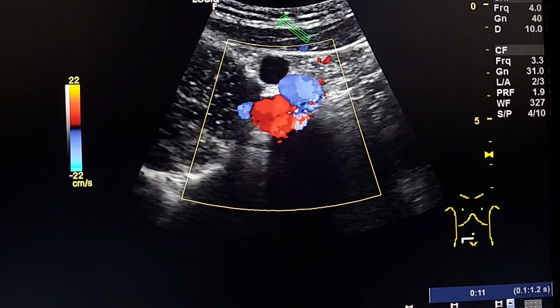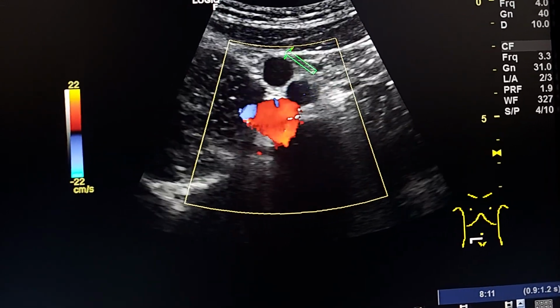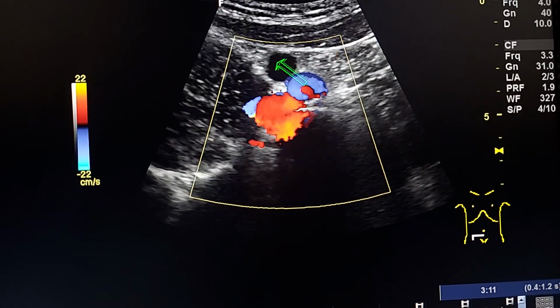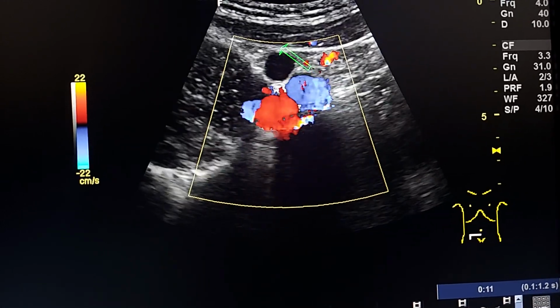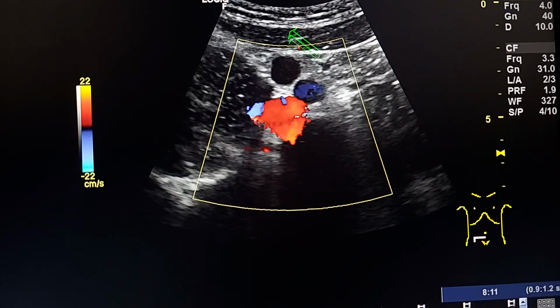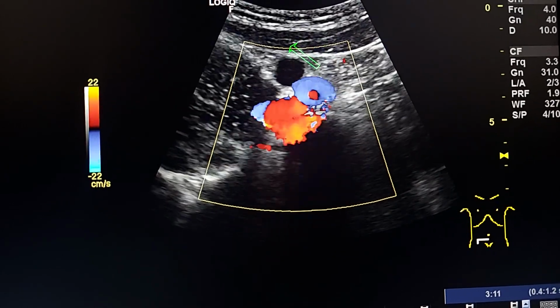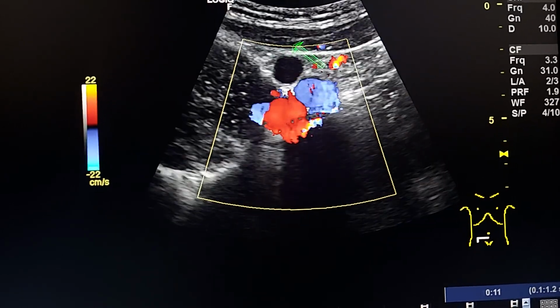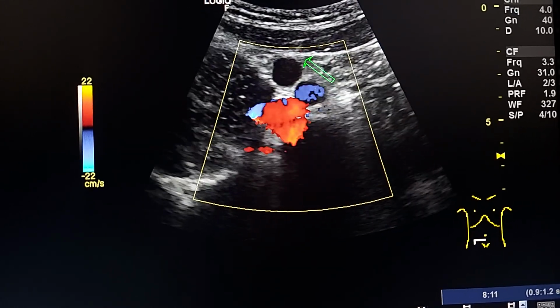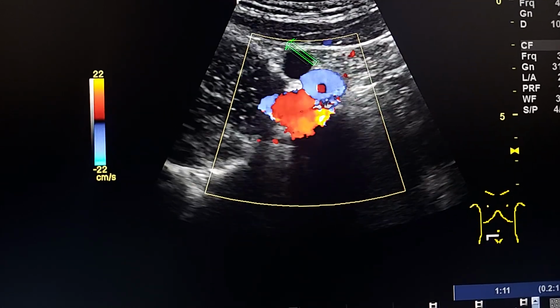Here we can see that the anterior abdominal wall is directly anterior to the ureter and the vessels as we pushed it while examining, and we don't see any small bowel between them. The small bowel are pushed away from the area.